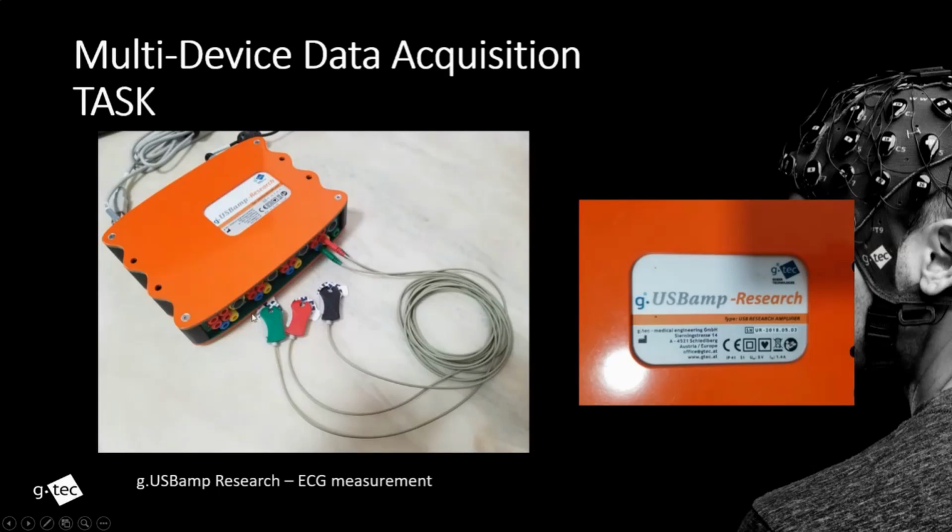So it allows us to measure 16 independent channels of EEG or other biosignals. The great thing about the USB amp is it has 4 independent groundings. For this instance, I'm using just one set of grounding. So you can always connect different kinds of EEG with a different grounding or different kinds of sensors, as long as the sensor has 1.5 millimeter touch-proof connectors. The USB amp allows connection for 16 channels up to 64 channels. So you can set up multiple USB amps and synchronize all the data through hardware.